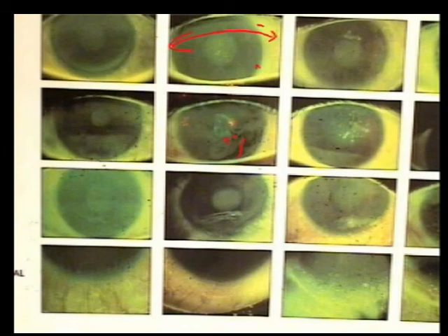If you get patients that have a very short tear breakup time, then it can affect not only comfort-wise, but also visually. So hopefully we have patients that have breakups between 12 and 15 seconds, and we'll talk about how you would check that and how to do that with a slit lamp this weekend. If you have a tear breakup time that's less than 10 seconds, then you clearly have a dry eye patient and probably do not want to fit them with contact lenses.